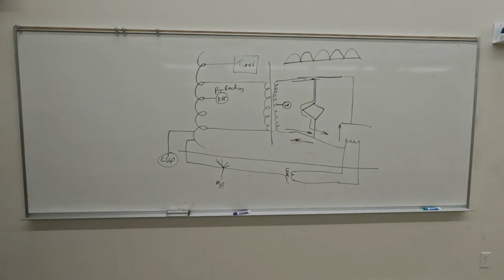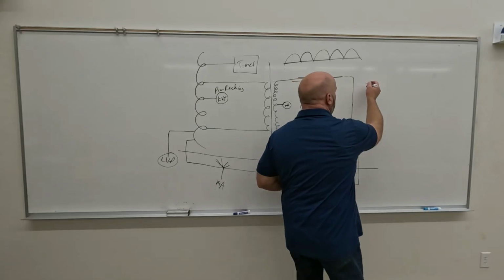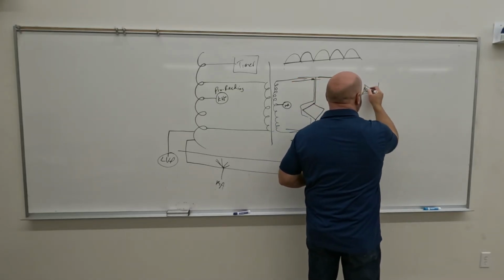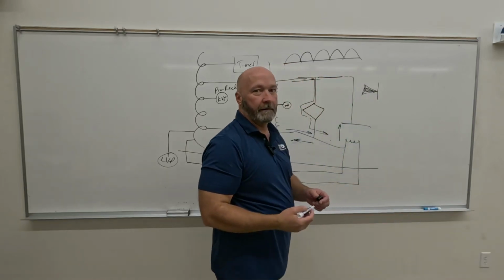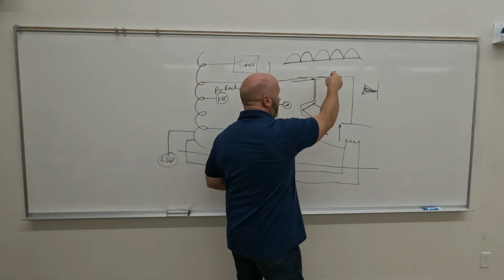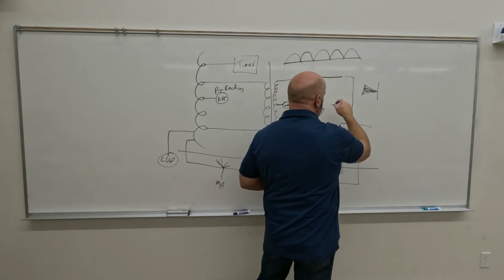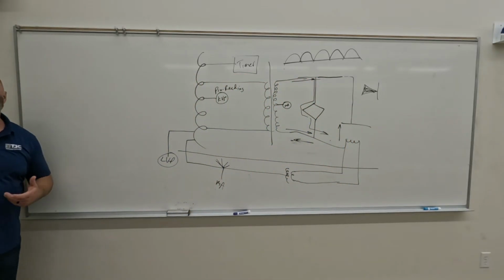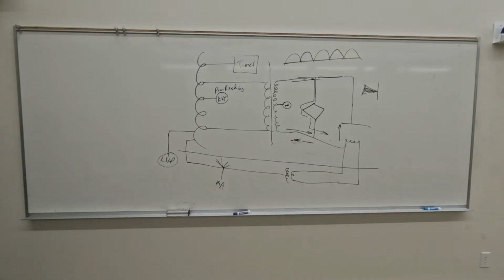If you look on page 109, you see where right before the X-ray tube in the pink part, you see these things that go like this. It's like an arrow, and then it's like that. That's the rectifier. The way he's got it drawn, it kind of makes this funny little circuit, and on the top and the bottom, those are the rectifiers.